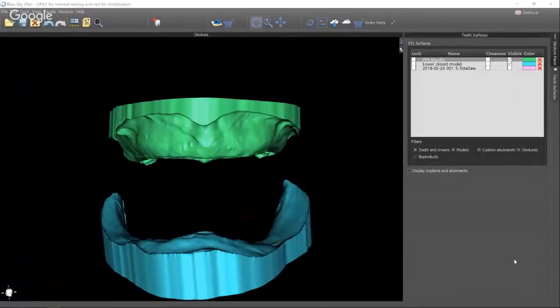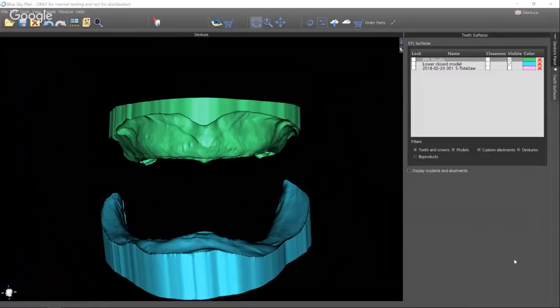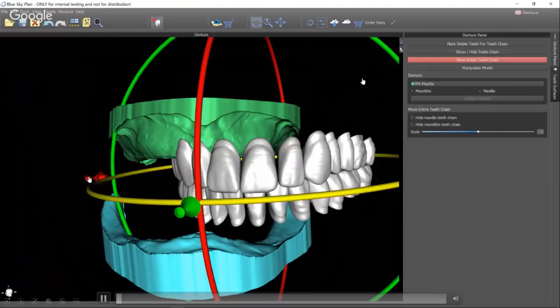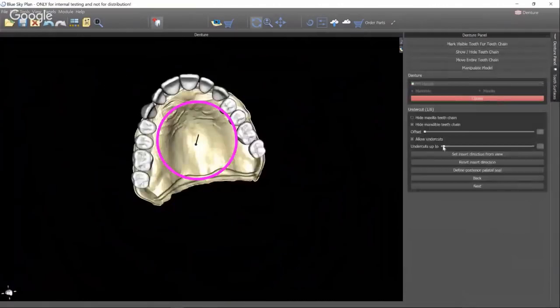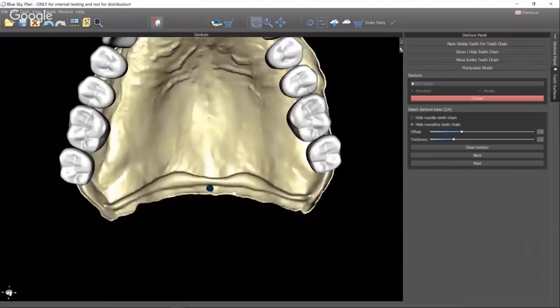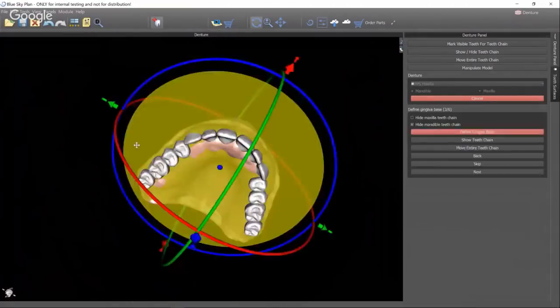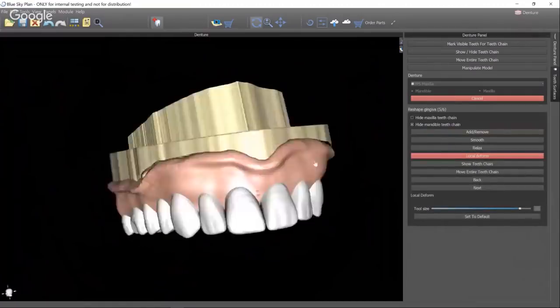So I've described for you in general how the process works. I like to be able to see it, and so this is a really, really fast, high-speed video of doing this process on that exact case. So if you just watch, you'll kind of see this whole process in action. So here I am importing the teeth, setting them according to the existing dentures. Now we're doing the insertion axis, and now defining the base outline. Okay, we're defining now the base, and now we're doing the digital festooning.